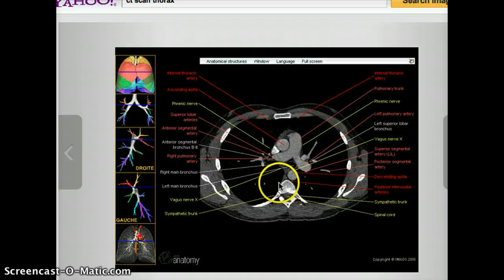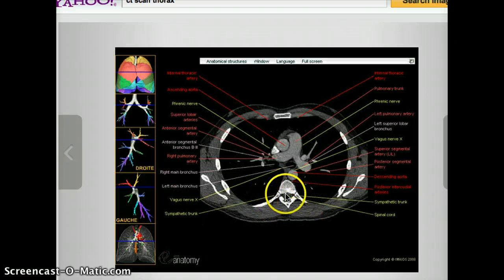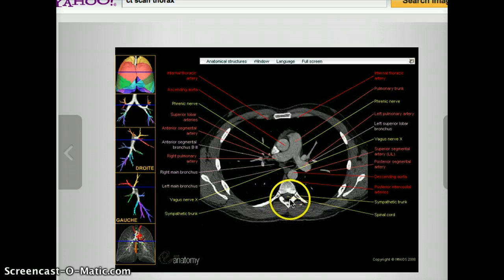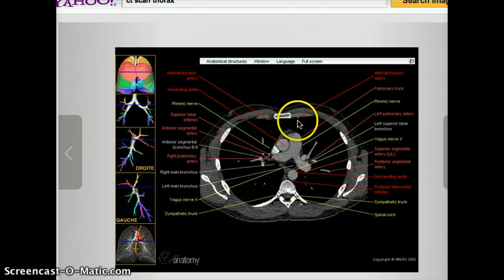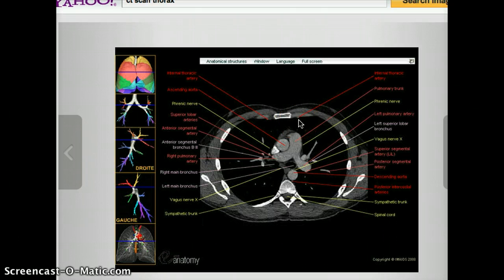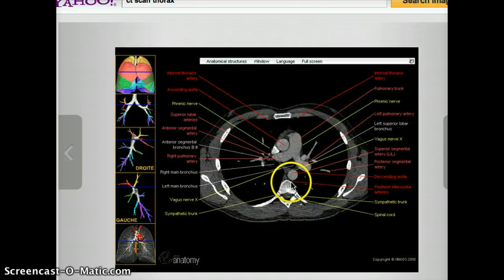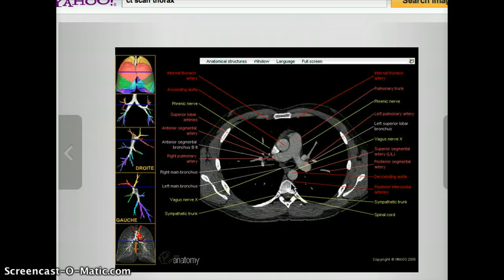The sympathetic trunk is kind of behind the column on both sides, and in the middle there is the spinal cord — we can see that the spinal cord is grayish in color. The internal thoracic artery can be seen at the very front as a little white dot. And right behind the aorta is the posterior intercostal artery.